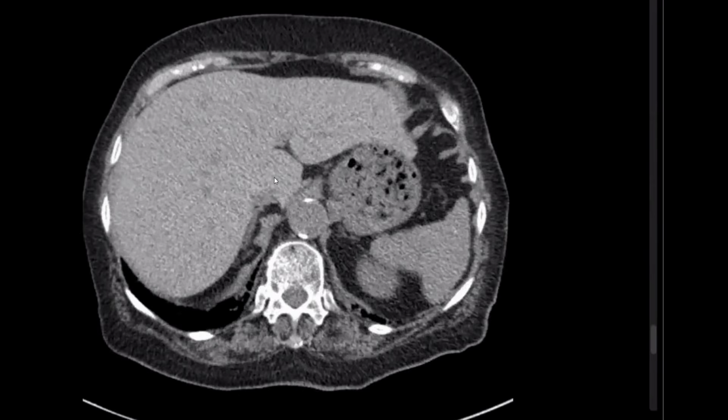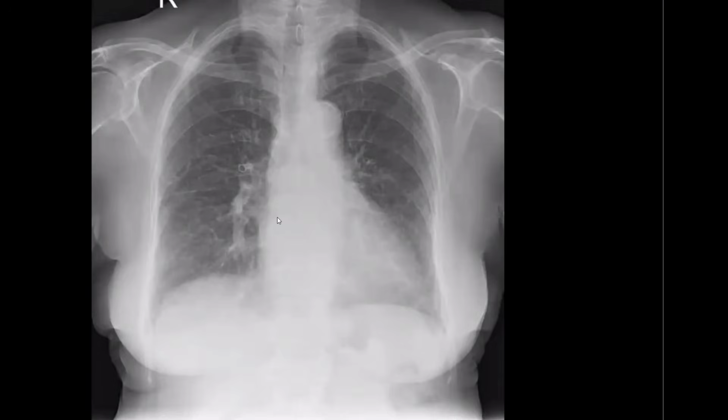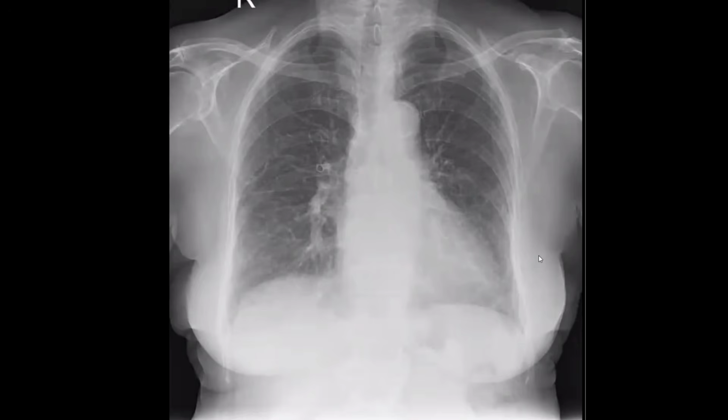Very nice. By the way, in this case, the amiodarone drug was stopped, and later on, the chest X-ray was almost clear. This highlights how you can search for the cause and identify the cause correctly. You will help the clinician to solve the problem and manage the case successfully. Okay, thank you so much.